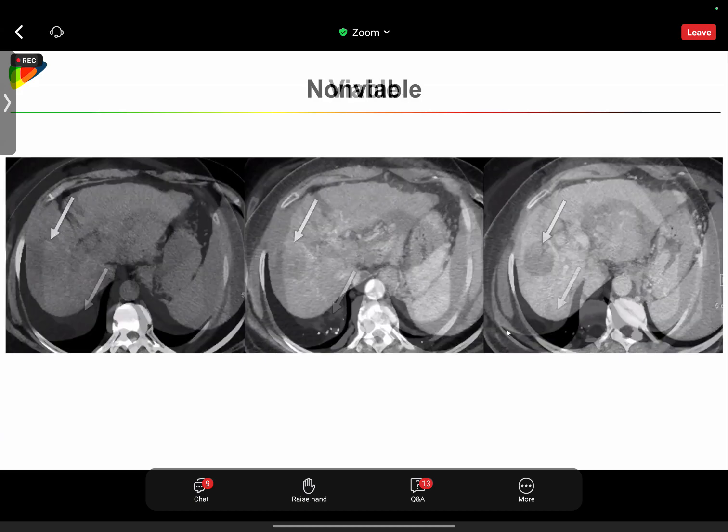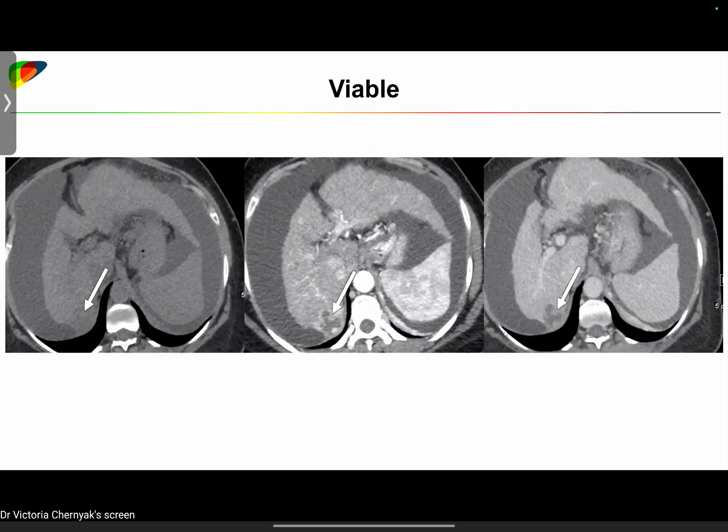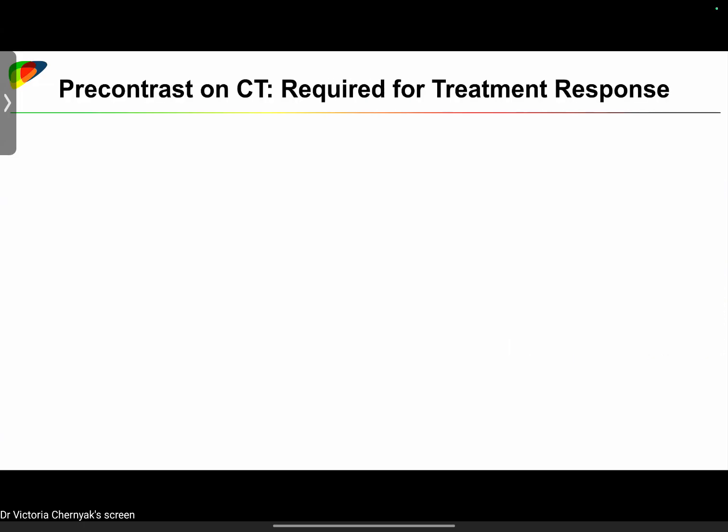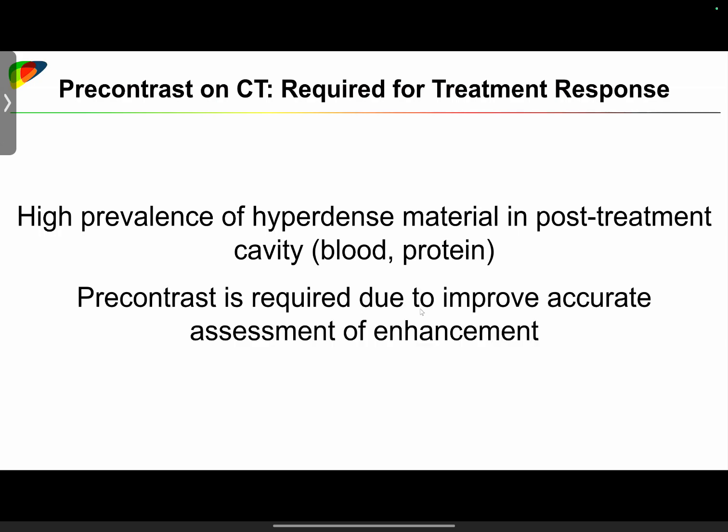and these are true areas of enhancement. So if the patient had prior treatment, we have to have pre-contrast because there's very high prevalence of hyperdense material in the post-treatment cavity. And then we need to have pre-contrast to assess whether or not there's enhancement.